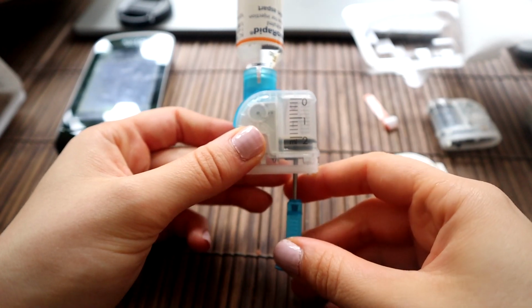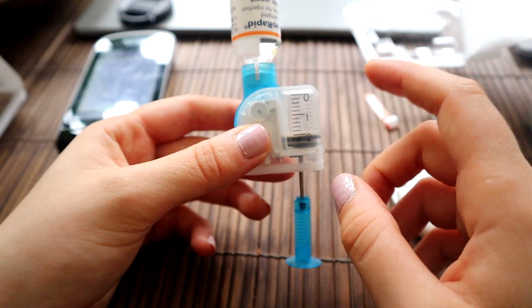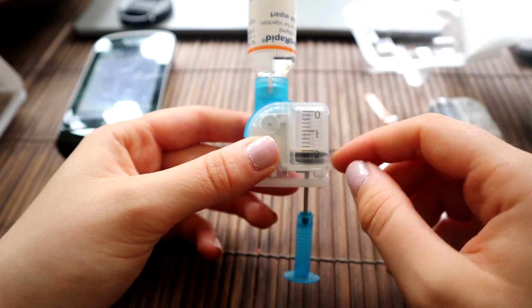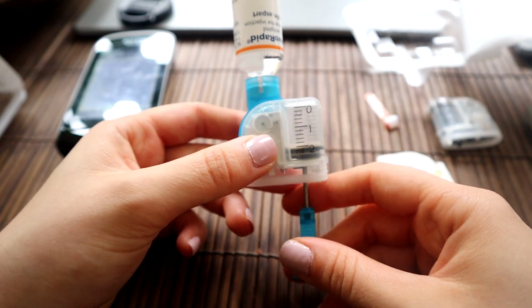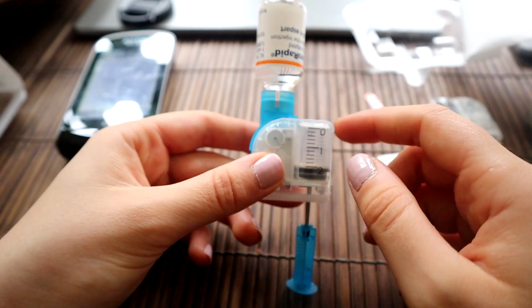Okay, so you can see I've filled it all the way up and there are no bubbles. When I was only changing it every 2 days, obviously I wouldn't fill it up the whole way. I did about 160 units of insulin, but because this is going to be lasting me the full 3 days, I now do the full 200 units.